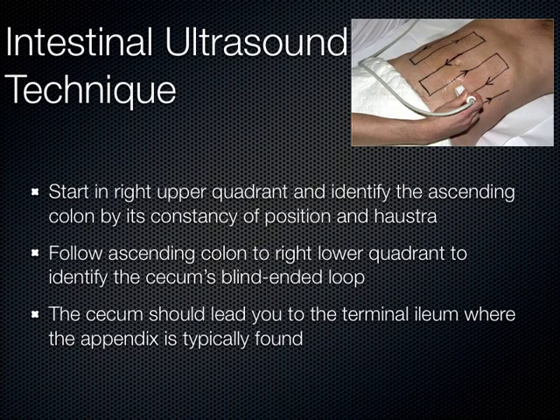Now, if there's air in the colon and the small bowel, it's very difficult, if not impossible, to see. And you have to do a really active compression of the intestine in order to see the walls. But when there's fluid there, which is especially true in disease states, then we can see the haustra versus the plicae very easily.